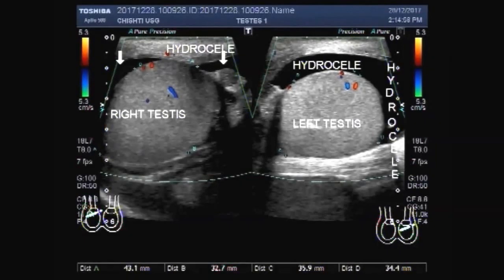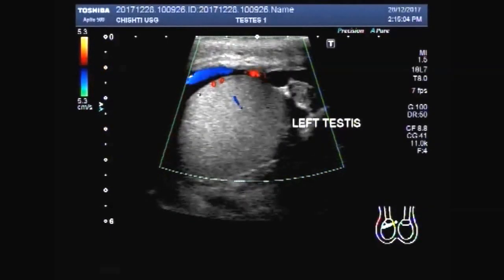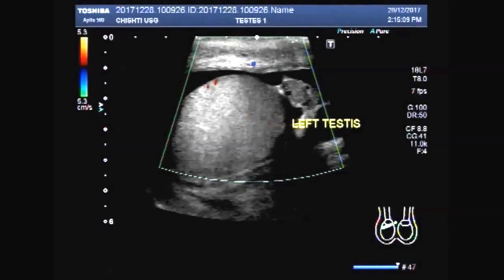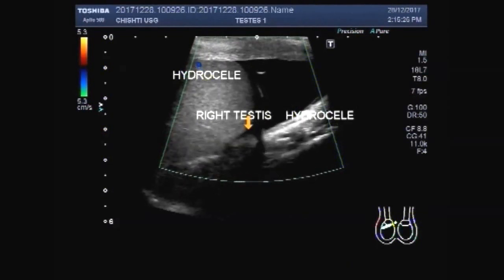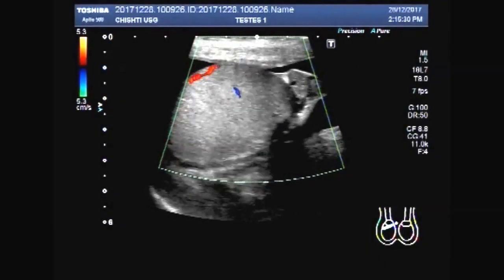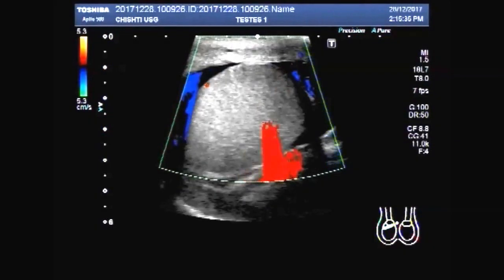You can see the testes. This is the right testes, and the fluid is seen in the scrotum around the testes. The fluid is clear, with no pus or internal turbidity seen.